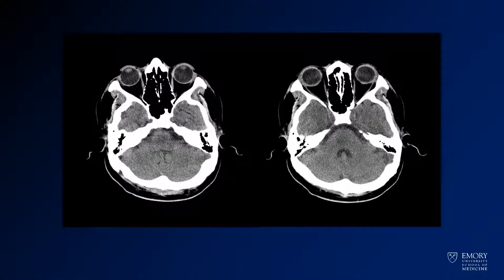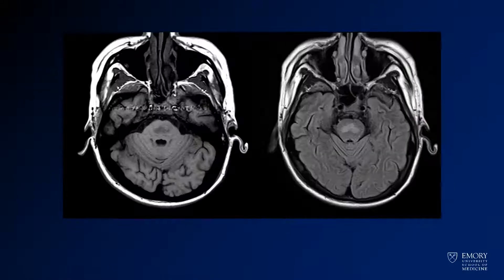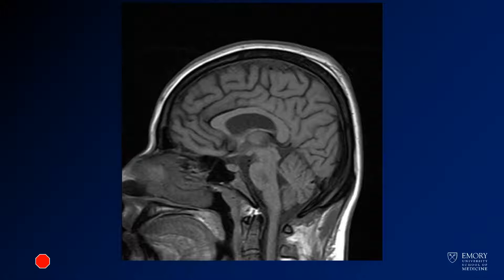Here we have some CT images through the level of the pons. If you're thinking that's relatively normal, that's okay. Here we have some MR images through the same region — T1 on the left and FLAIR on the right. Here we have a sagittal T1 image through the same region.